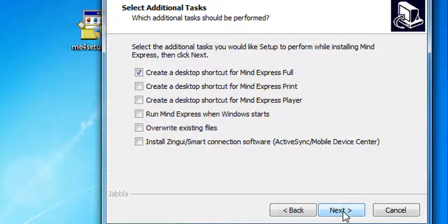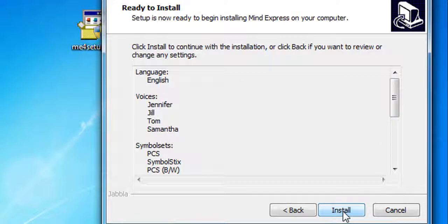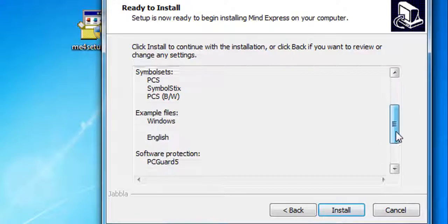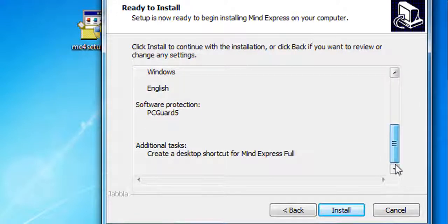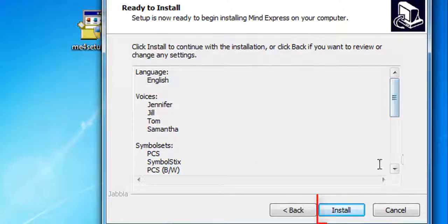At this point, review your settings and then click Install to proceed with the installation.